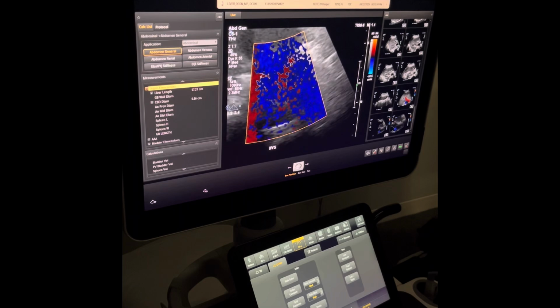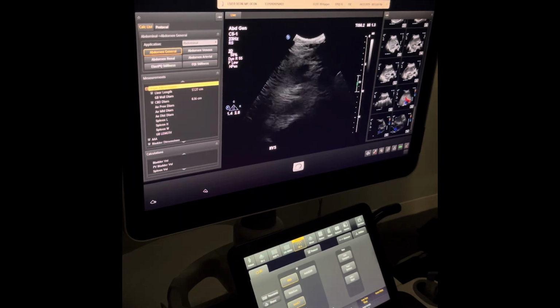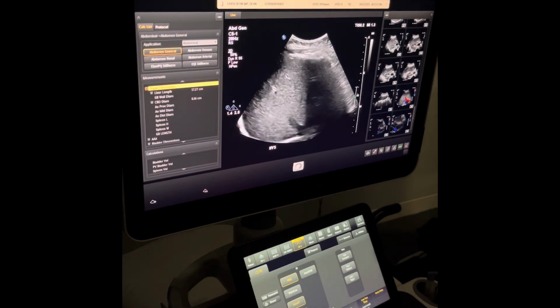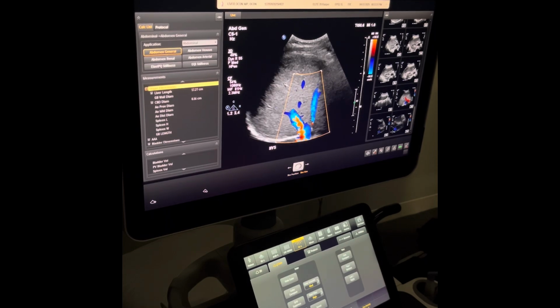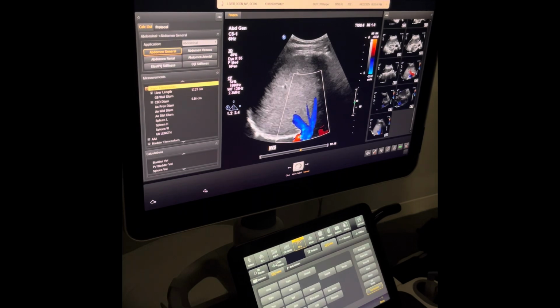And next, I'm still going to stay intercostal to try and get the hepatics. And so for that, I'm just going to angle up slightly higher than I would for the portal vein. You can kind of see them coming in here. I'm going to throw color on. So we can see the right and the mid coming in nicely. So I'm just going to take that. Ooh, I have to change my label to right and mid.